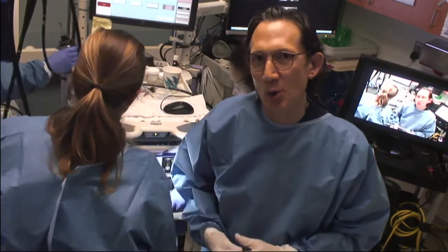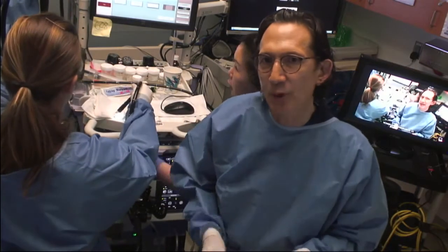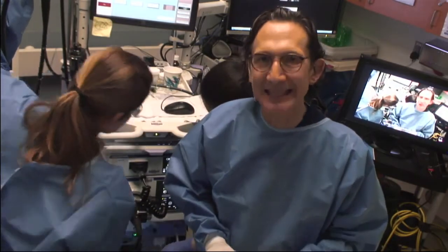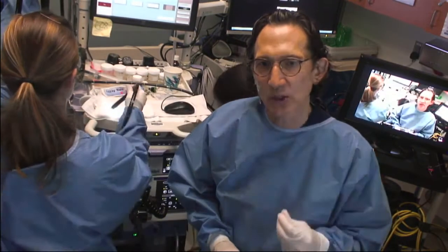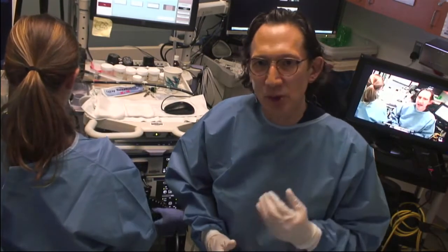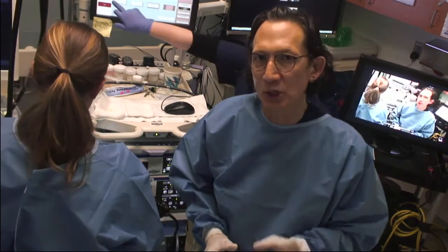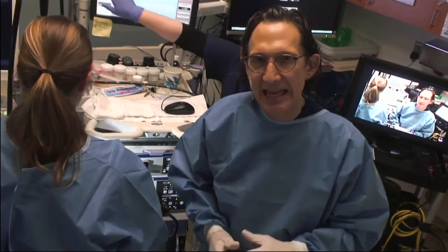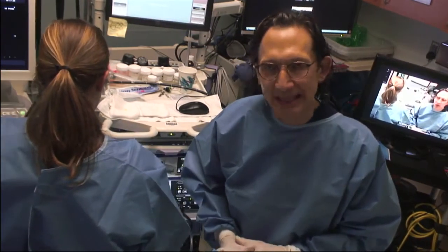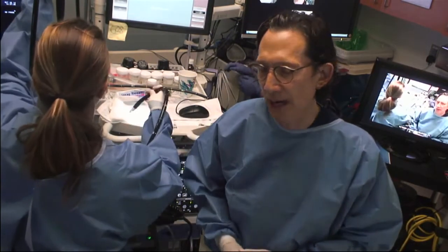The forward view scope is an interesting scope that I was using quite routinely for one major reason, and that is that you have a water jet channel, and I really like that. There's a water jet channel that you can use to flush away any debris or clots. And sometimes, if you have a patient with active bleeding, it's very useful to have that forward view. And it has a 3.7 millimeter channel. So those are pluses. But you can certainly do this with a standard curvilinear array.